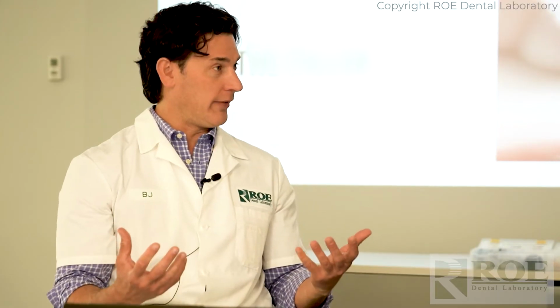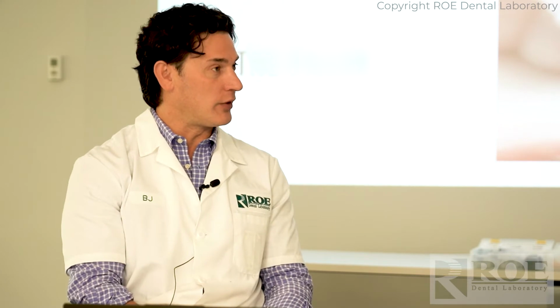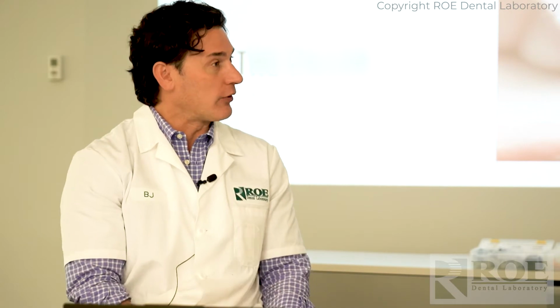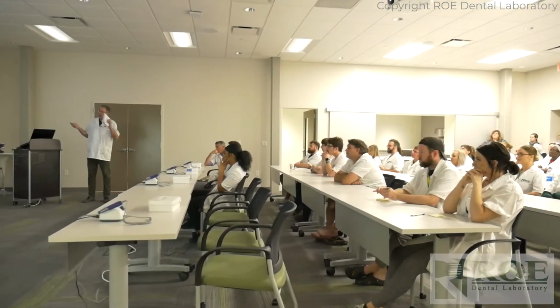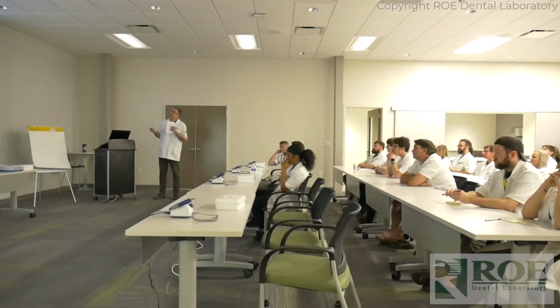There are a lot of things clinically that can affect contacts, can affect their tightness or position, but certainly the amount of contact it has with adjacent teeth. What are some things that happen in the dental office that the doctor can keep an eye out for? We need great, clean impressions. Hopefully your temps are stable, with a contact similar to what you want in your crown, and let's get it in here and get it back to you as soon as possible, just to make sure nothing is shifting and as little time goes by as possible.